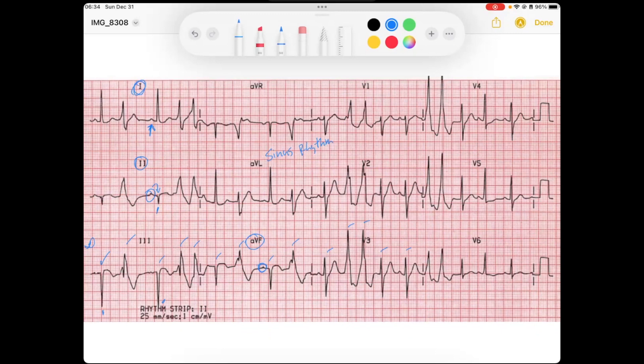For those normal beats, we do have a normal PR interval — the PR is less than 200 milliseconds — so that means there are no AV blocks.